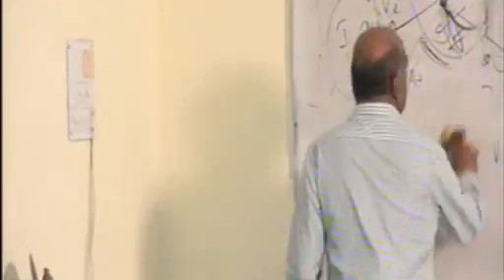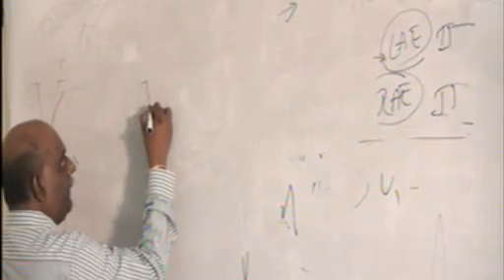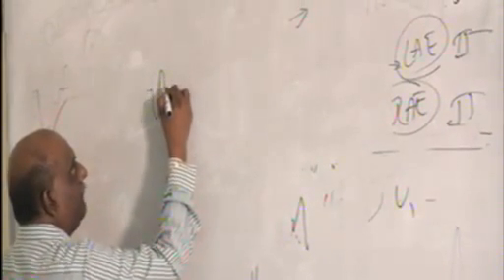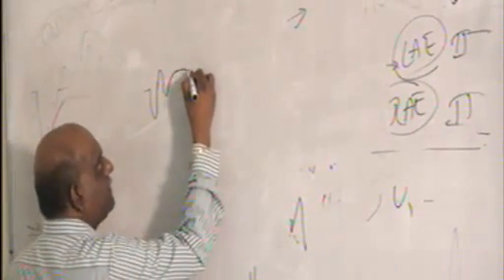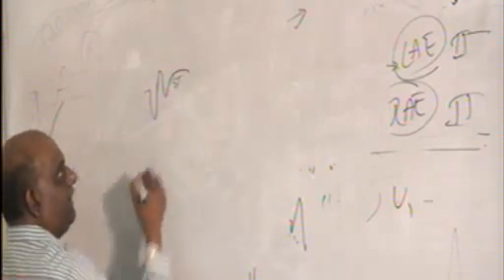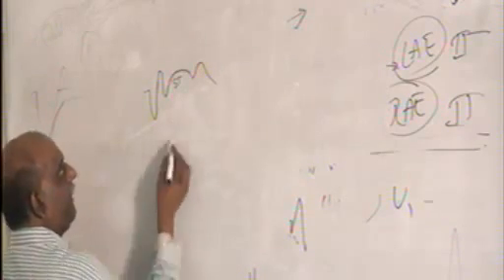I will show you how it looks. I am once more showing you on the board. Q wave, then you are having an elevation like this, ST segment elevation, and then the T wave is appearing.